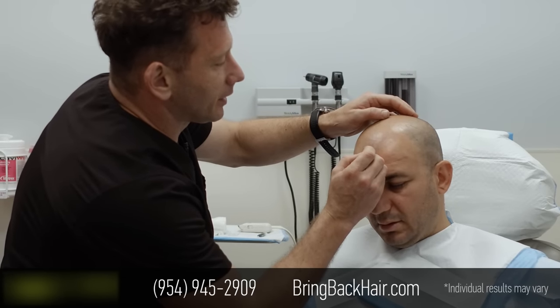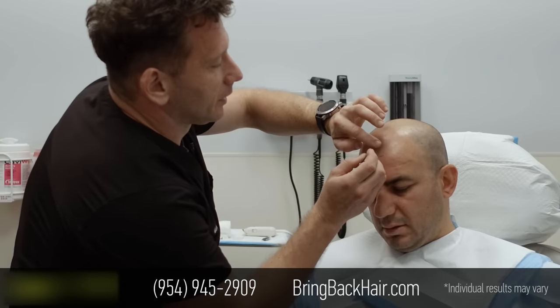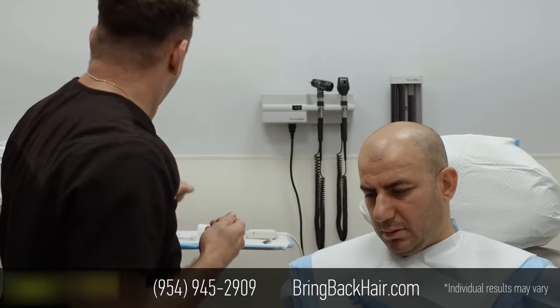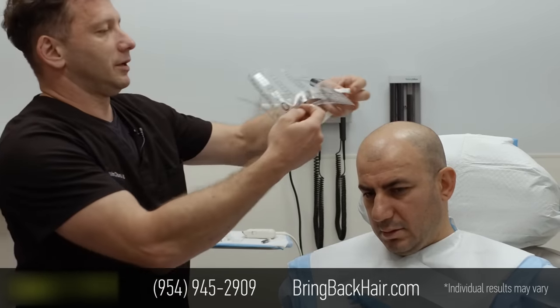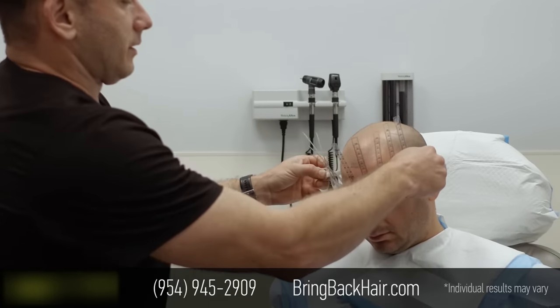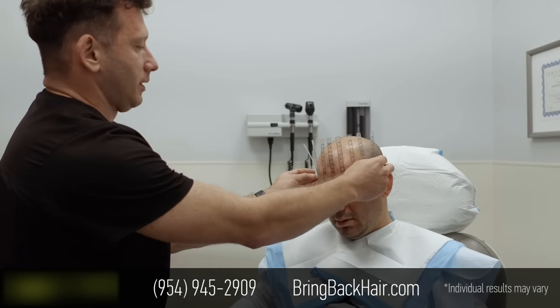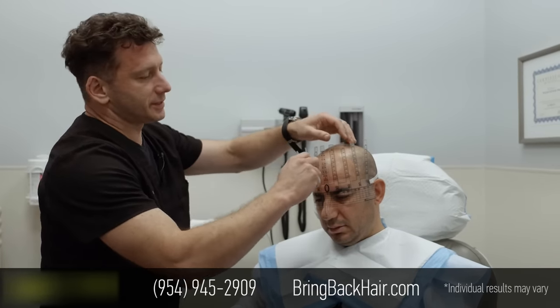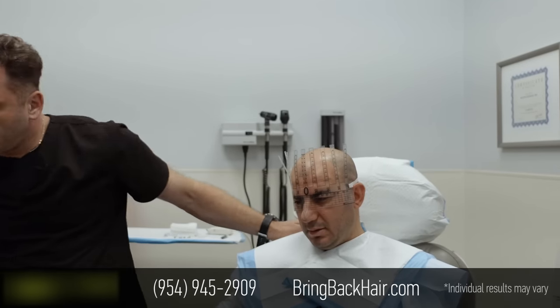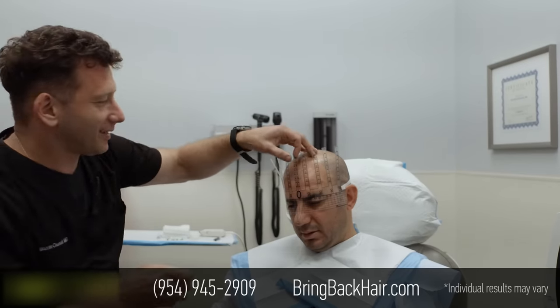We're going to start with the hairline, the anterior part, kind of to mimic what the lowest hair is here. I'm using a tool that helps us to place those dots symmetrically on both sides.